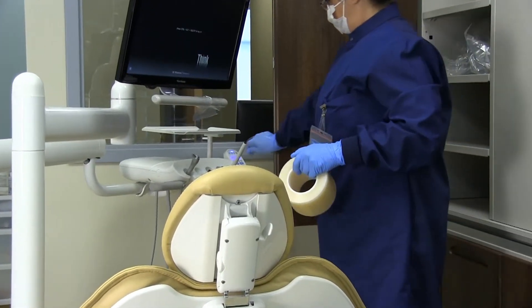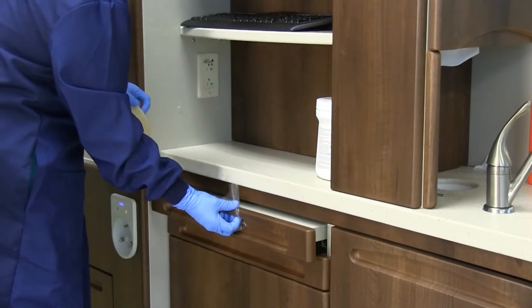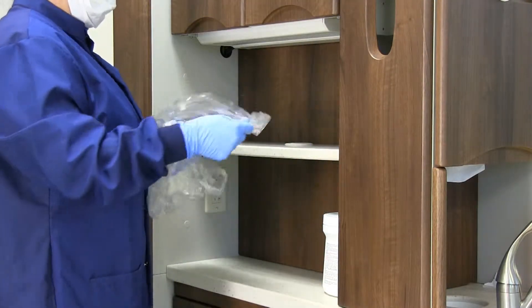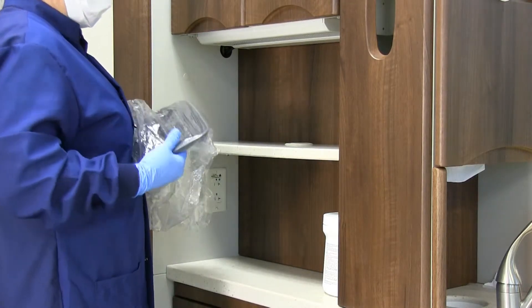Also place barriers on the cabinet drawer handles. You will place appropriate barriers on handles that adjust the computer monitor, keyboard, and mouse using extreme caution. You will cover the keyboard with a special barrier.